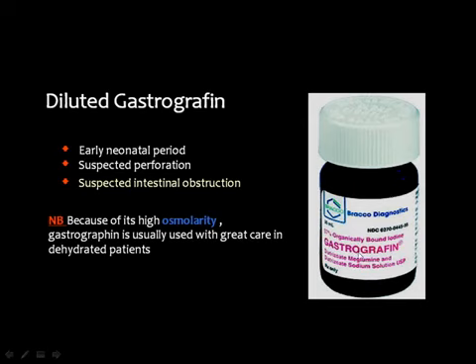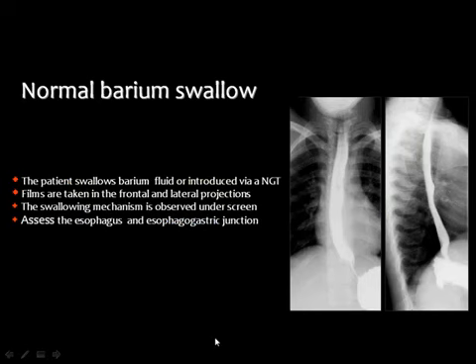Also, we have what's known as water-soluble contrast medium, which is known as the gastrografin. And this gastrografin can be given for the neonates and also in cases with suspected bowel perforation and some cases with intestinal obstruction as well. But please note that this gastrografin has a high osmolarity and it should be given with great care, especially in dehydrated patients.